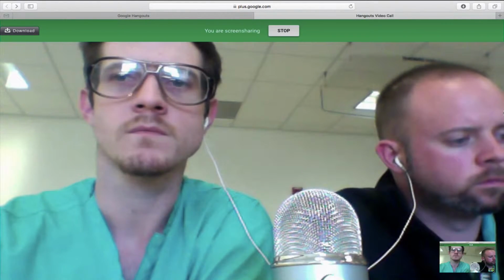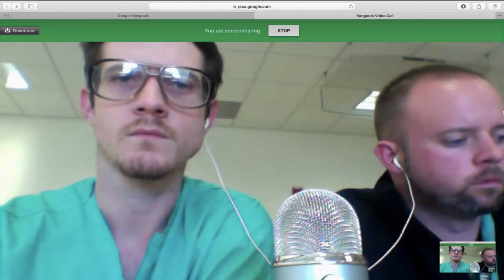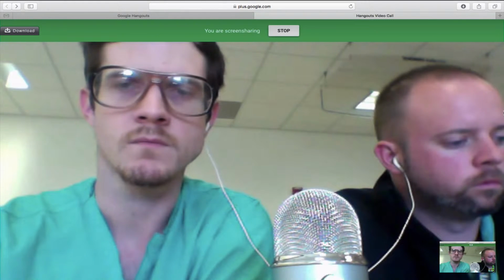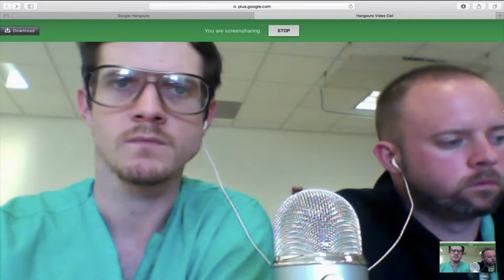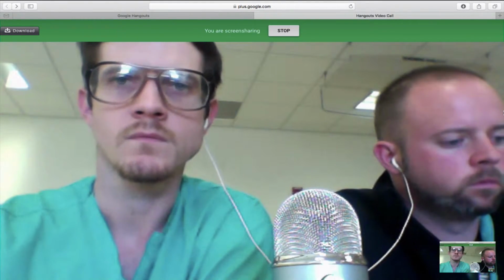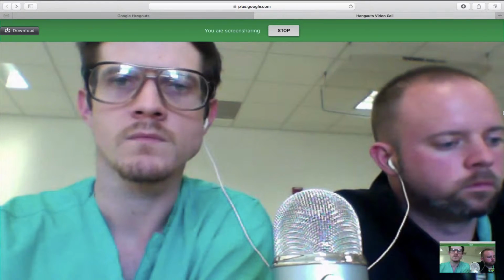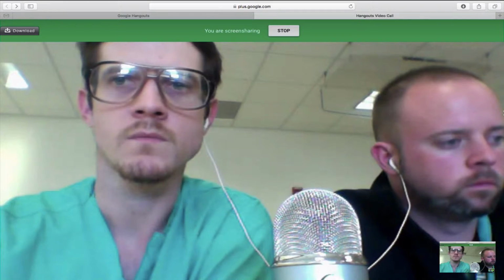We're talking about millimeters, so that can make it challenging if they're moving their eye all around. And you can also have some artifacts. Sometimes the optic nerve will shadow in a certain way, and people tend to measure it a little bit thinner than it actually is. You have to take careful measurements. You have to have some practice in it, and you should always do it bilaterally.